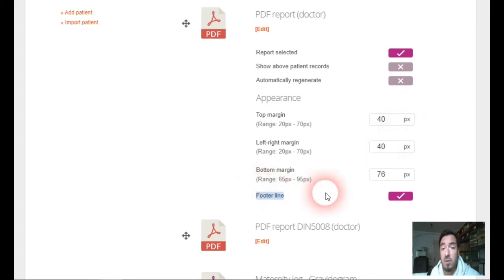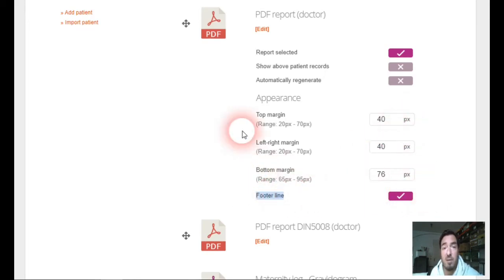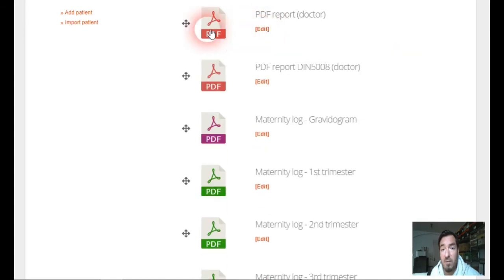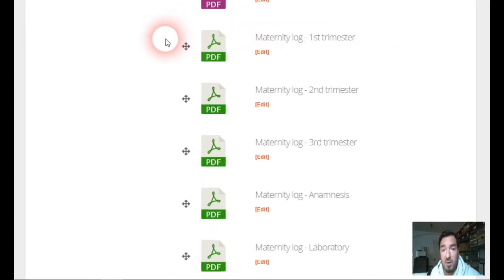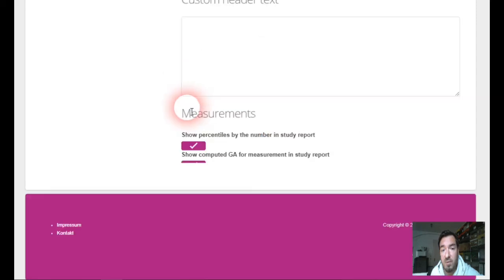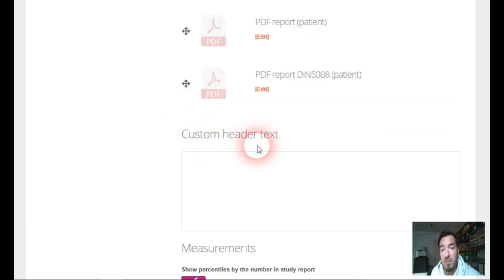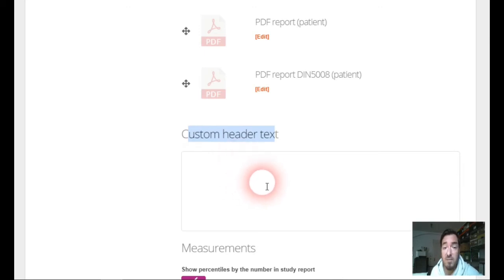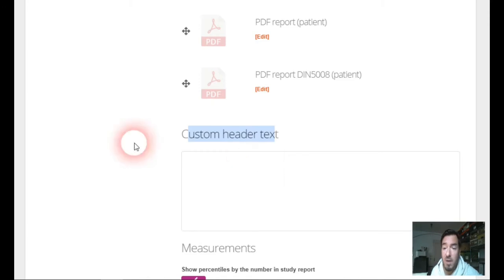You can even choose if the footline will be displayed or not. And this is what you can do on every report. If we scroll down here in the report field, you can find the field custom header text.